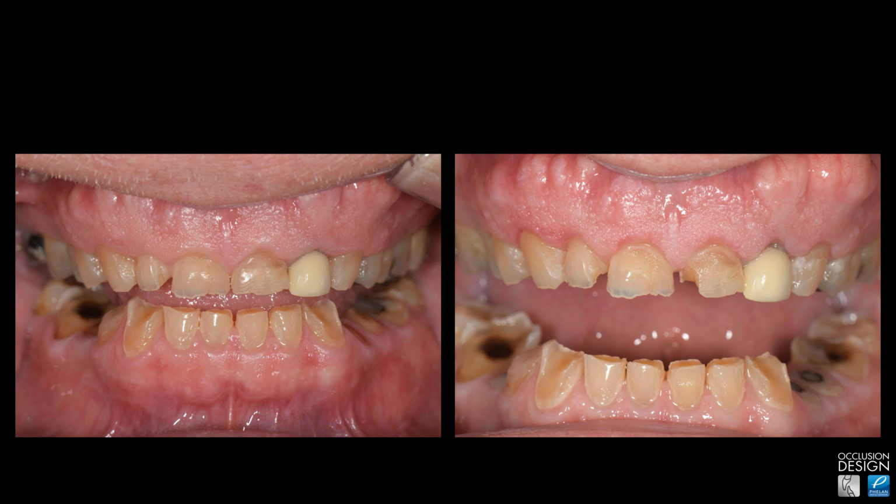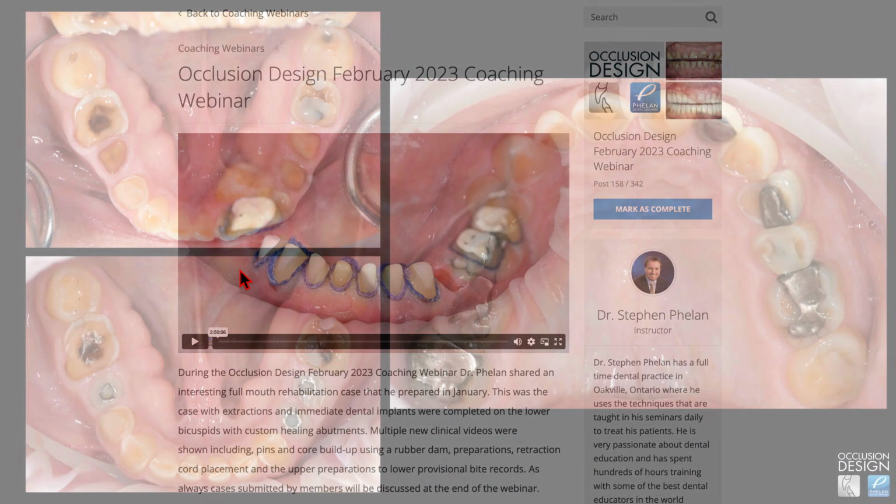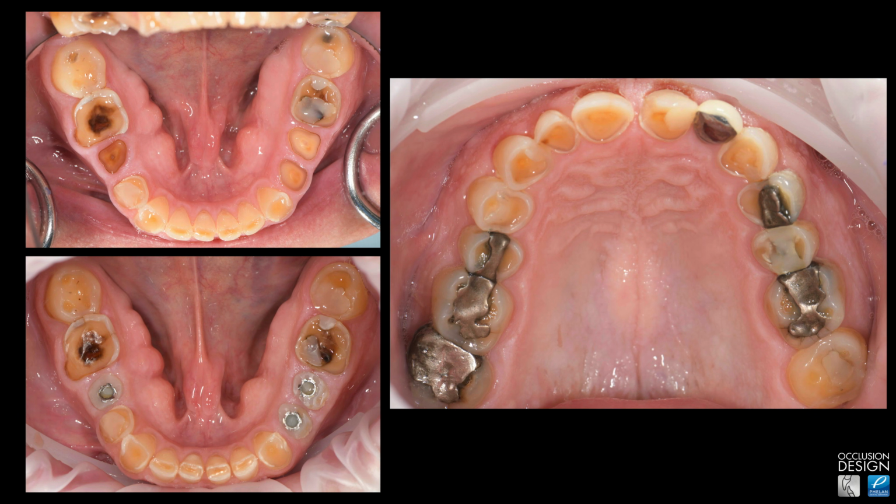And I showed a number of clinical videos from the case. I'll share with you a little bit of the content from this webinar, just to give you a feel, but also to let you see how I managed this patient's treatment. So this is just showing you the February 2023 member webinar. It was 2 hours and 50 minutes. I shared this case, we looked at some member cases as well, and answered all Q&A. And so here is the patient beforehand.